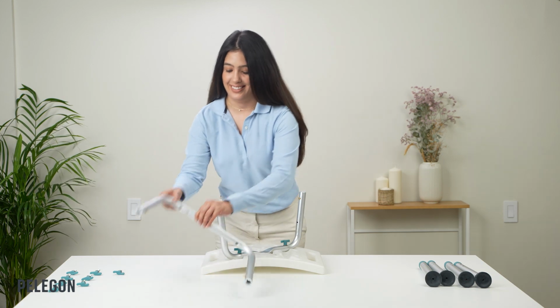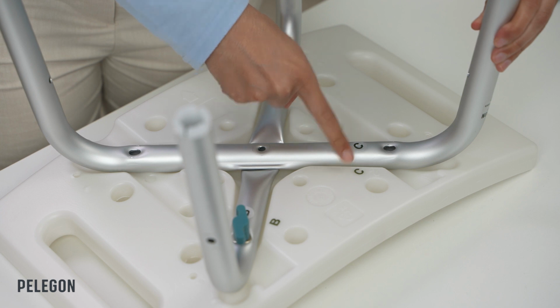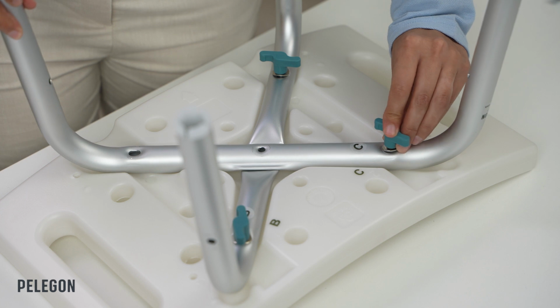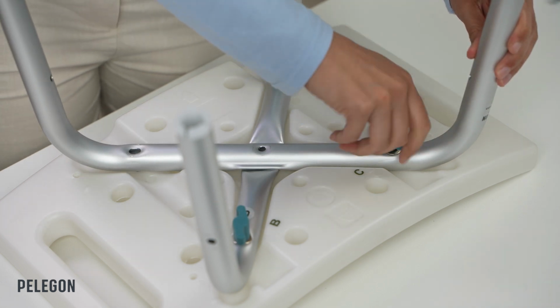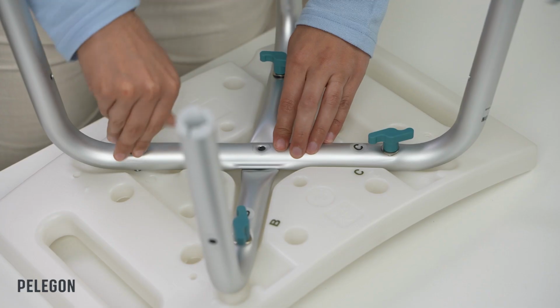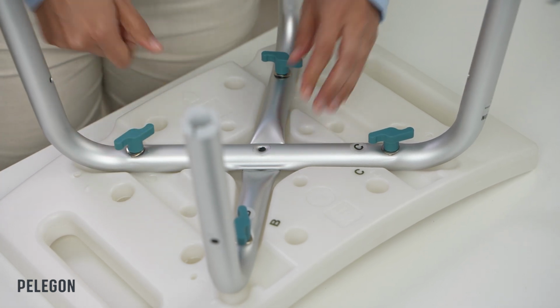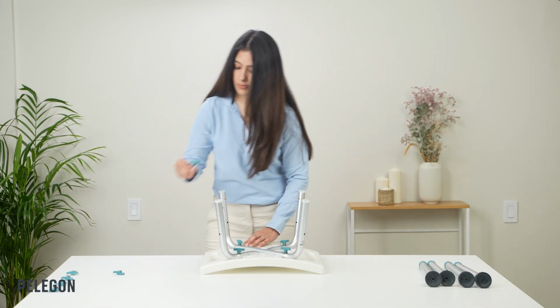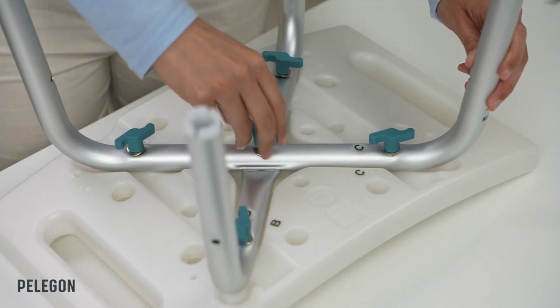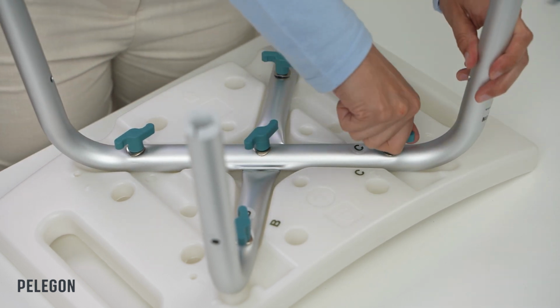Do the same with the other U-shaped bar. And again, notice that both seat stickers are aligned. Once in place, use 3 medium-sized screws to connect the bar to the seat. Once all 5 screws are in place, confirm they are fully tightened.